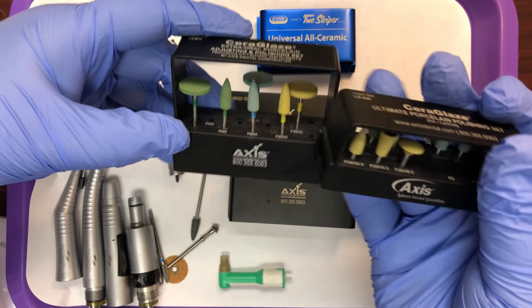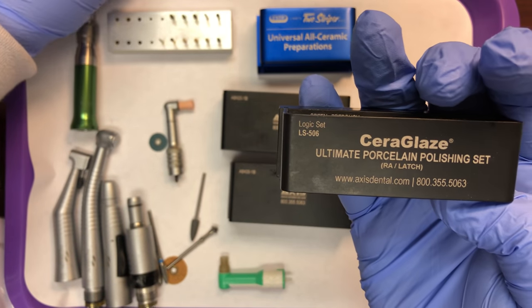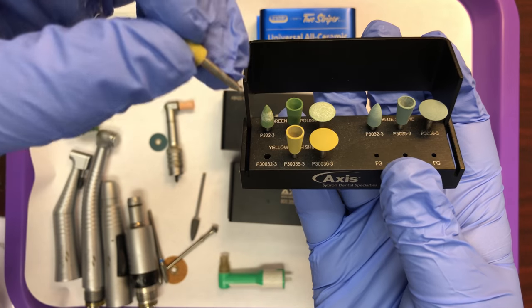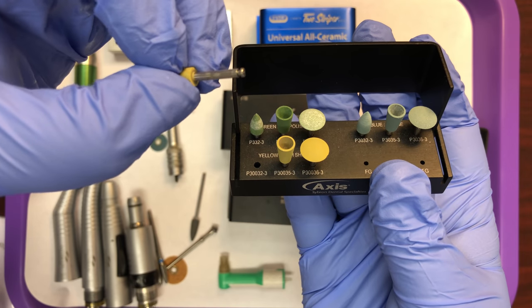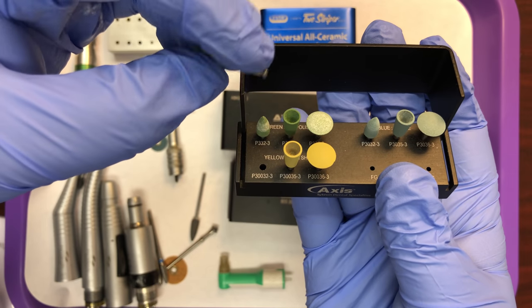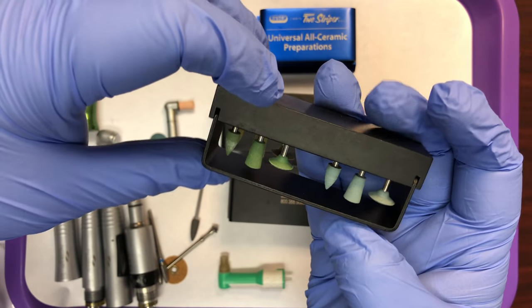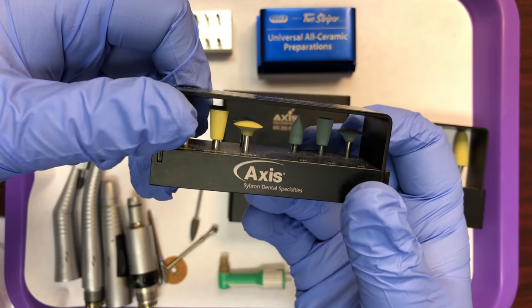These are also porcelain polishing burrs, but these are smaller so they can be used intraorally. If you notice the attachment style of this burr is a latch style. We'll talk more about the different styles in a few seconds, but there's just such a wide selection of burrs out there for the dentist to choose.